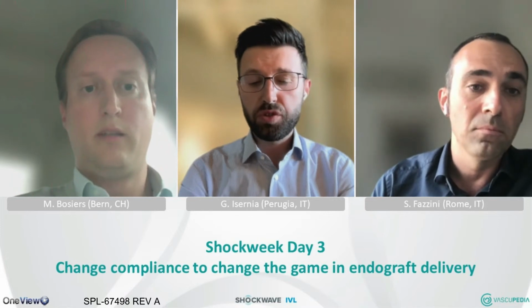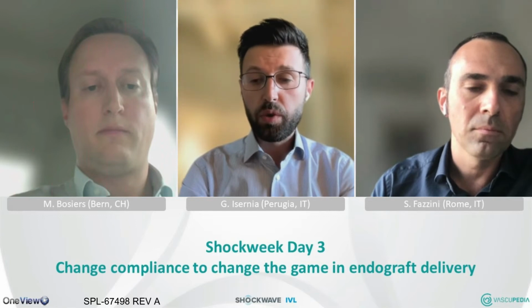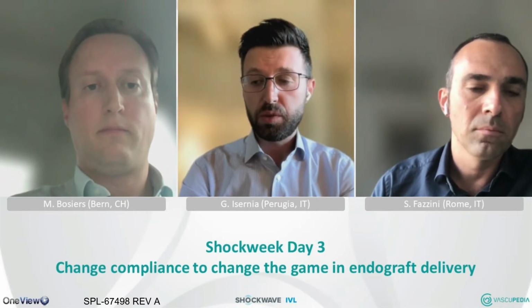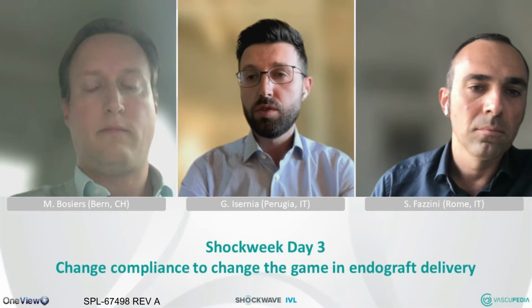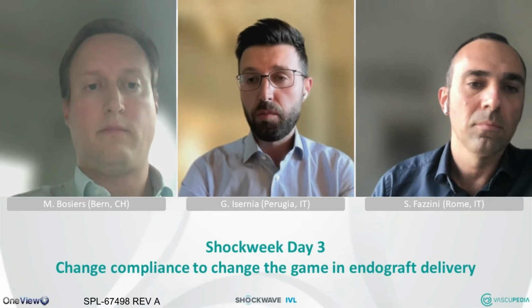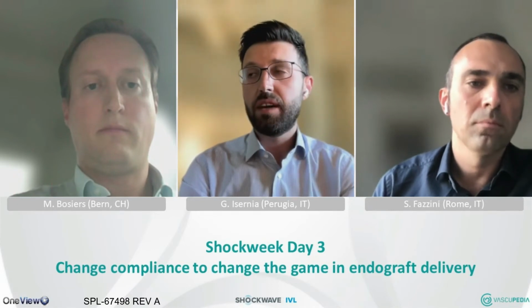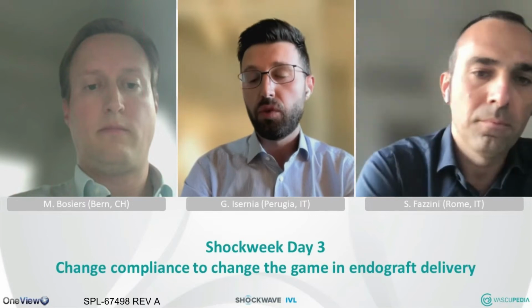Yes, Stefano, of course, honestly speaking, in this case, probably we could also perform an EVAR with a distal graft, and of course, including both common femoral arteries. But the problem is also to preserve the couple of lumbar arteries with an extensive proximal coverage. So this is another advantage that we have with this technology for this specific patient.